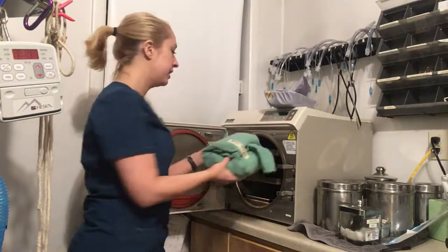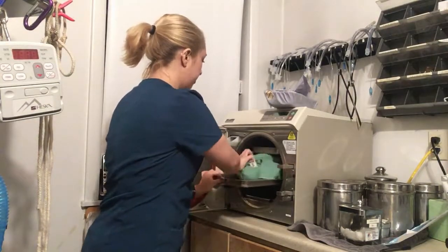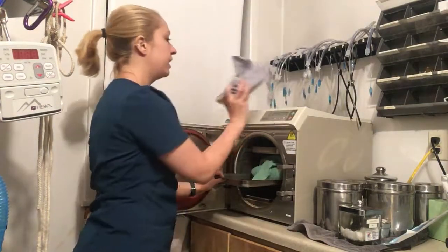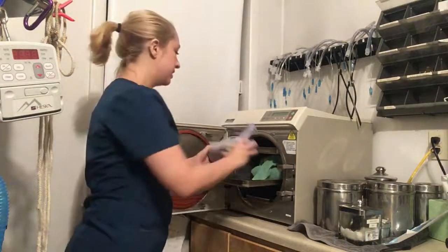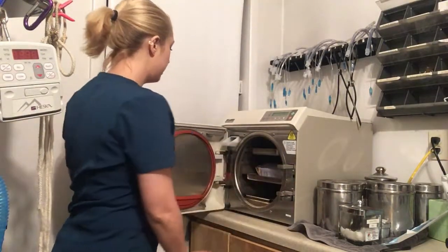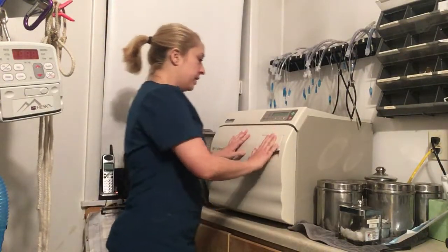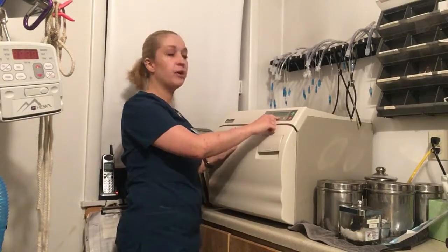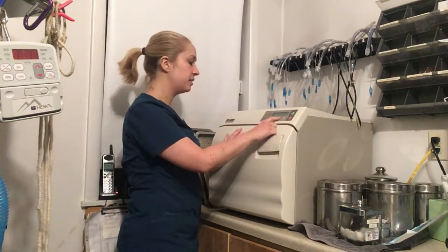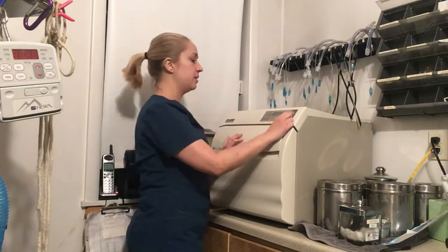Excuse me. So when you're pressing it in, you can pull out your drawers and get everything in. We have the packs that we wrapped earlier, and I'm going to go ahead and get them into our autoclave, and since I'm sterilizing packs, I'm going to select packs, and this one will last for about 30 minutes, and then we'll press start.